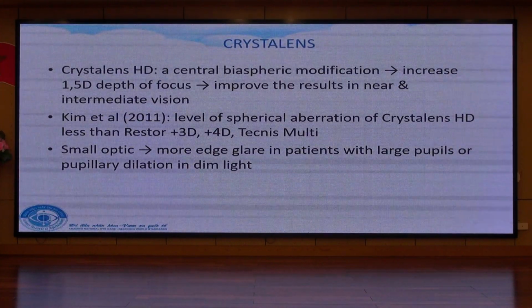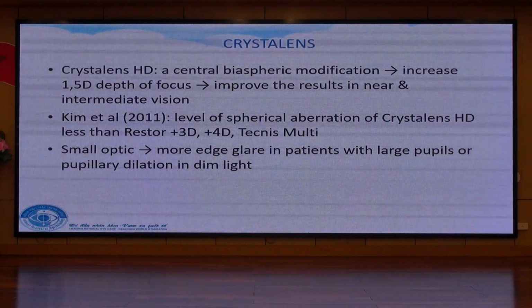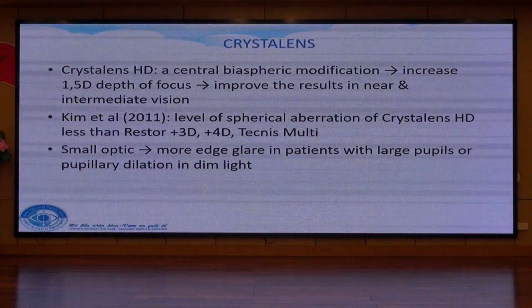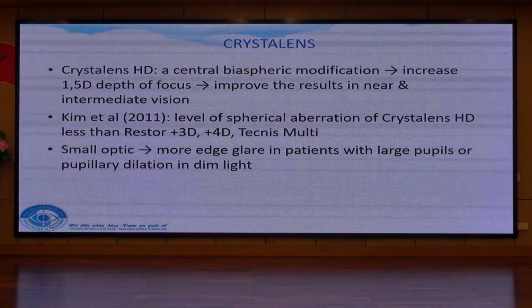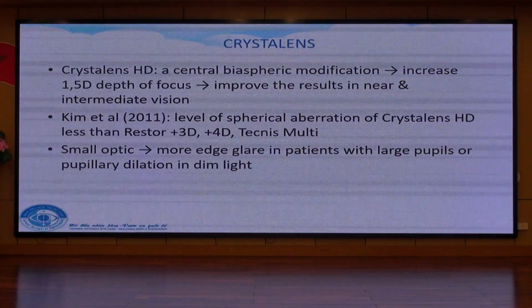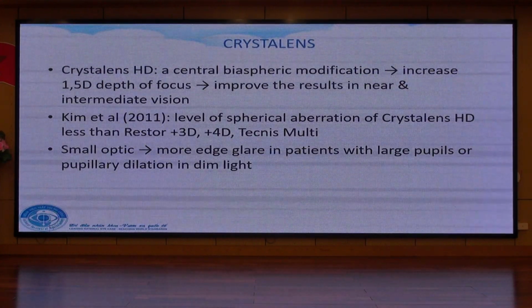The CRYSTALENS has a small optic, so there is more edge glare in patients with large pupils or pupillary dilation in dim light.